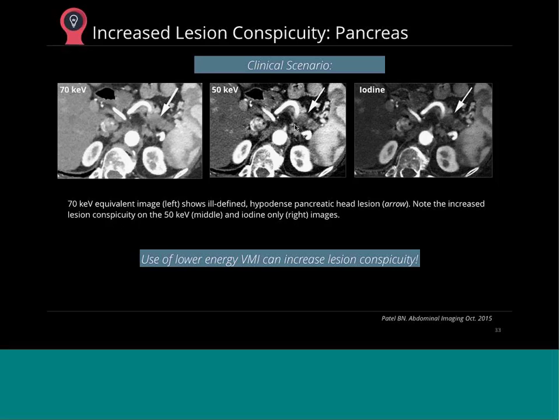Again, it's a little bit noisier. But just notice even the contrast in the aorta and the kidneys. Again, this tumor stands out a lot better here than it does here. Look at the iodine-only images. You could actually draw that.